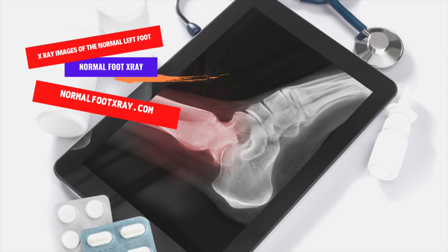X-rays of the foot are an important diagnostic tool for a number of reasons. First, they provide doctors with a better understanding of the anatomy and function of the foot. In addition to determining the condition of the foot, they can plan treatment and evaluate the outcome of surgery. Furthermore, a normal foot X-ray can detect a variety of conditions, from a broken bone to an infection.